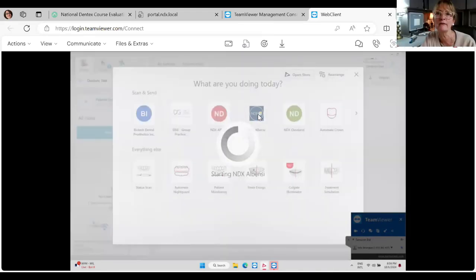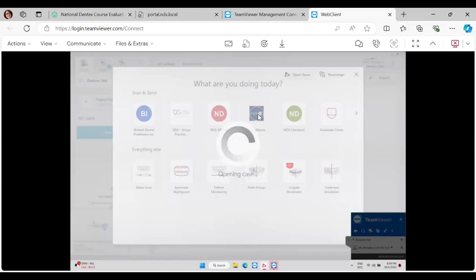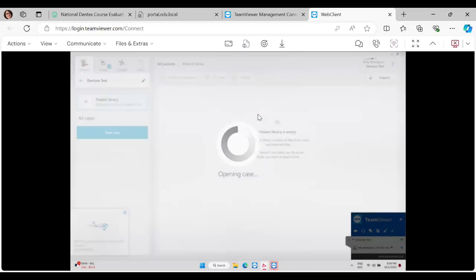Now you can see my screen, right? Yes, we can see your screen. And to answer a couple questions really quick.